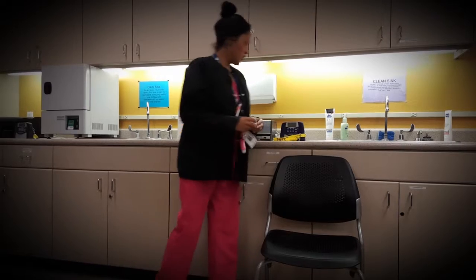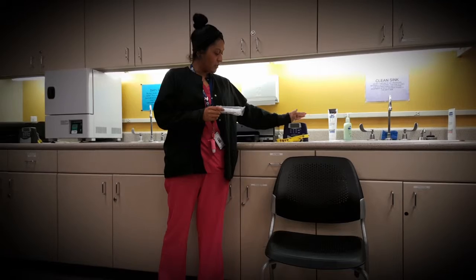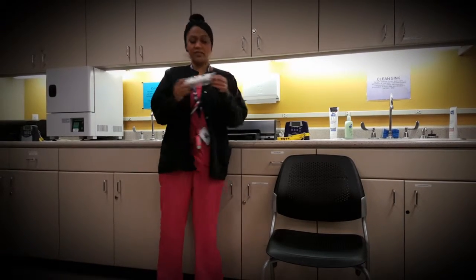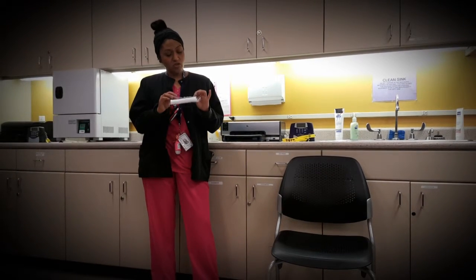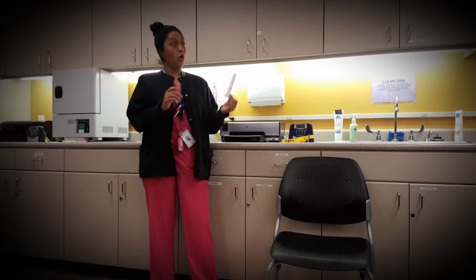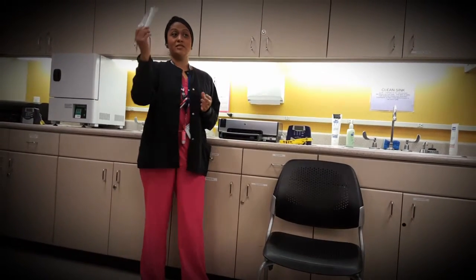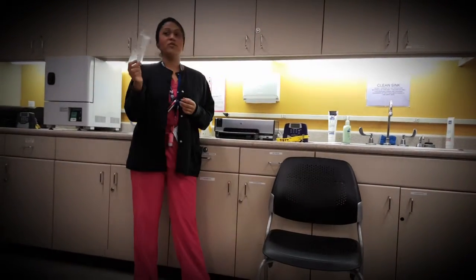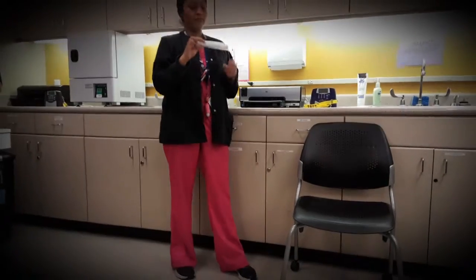Because we can't have multiple patients' mouths on the machine, we have these little spirettes. When you receive one, make sure you put your name on the plastic wrapper with a Sharpie — this will be your own spirette. If a patient loses it, we'll give them a new one, but this is what the patient will be using.